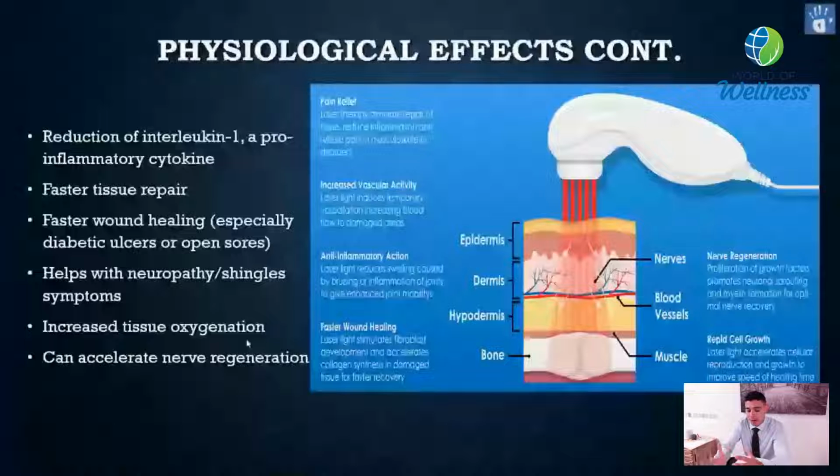The Graston tool, the umbrella term is called instrumented soft tissue mobilization. After we heat him up, he had trigger points, so his calves are really tight. Think of all his muscle fibers oriented kind of diagonal and just not a good lattice. Once we heat it up and then do some soft tissue, we're allowing his muscles to organize in a more linear fashion, so he's not as tight.